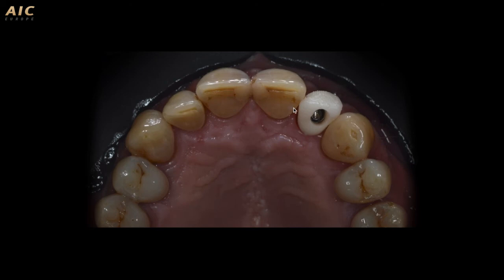We can see in this picture the shape of this tooth that is very similar to the shape of the other similar tooth, because thanks to 3D shape, we can copy and paste the shape of the other tooth to have what we want for the final result.